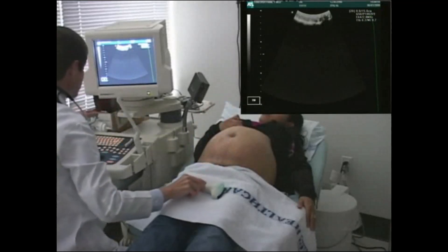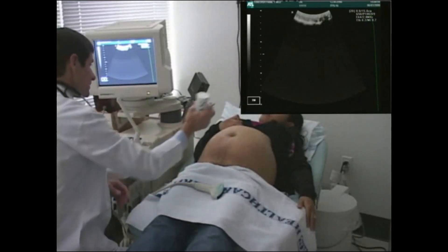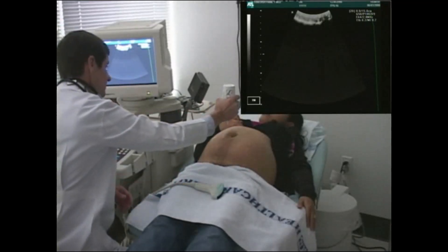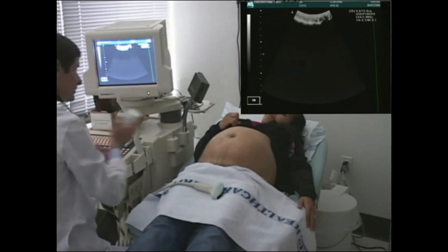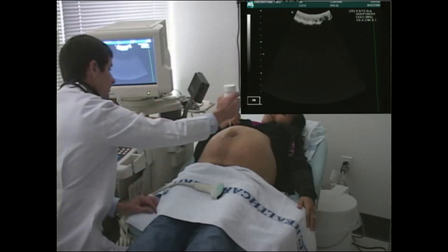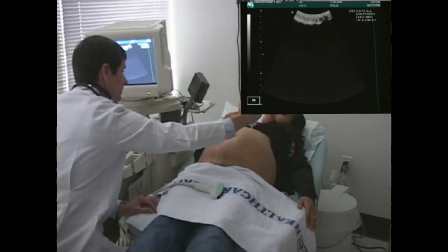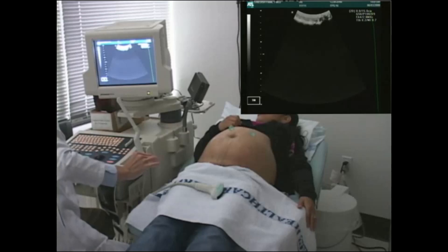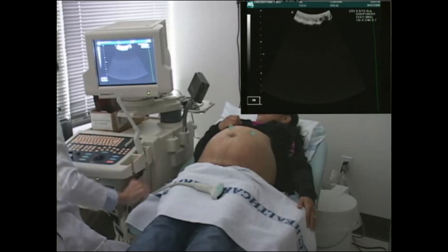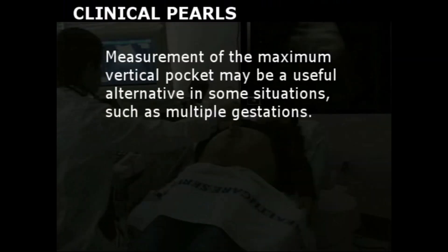Estimation and documentation of amniotic fluid volume is the standard of care during routine ultrasound examination. The AFI is a quantitative approach to estimating amniotic fluid volume. Other methods are purely subjective assessments, which make it difficult to follow trends. Measurement of the maximum vertical pocket may be a useful alternative in some situations, such as multiple gestation pregnancies.